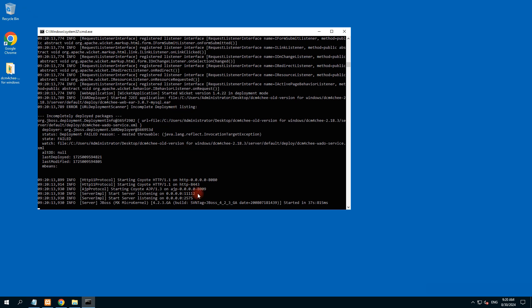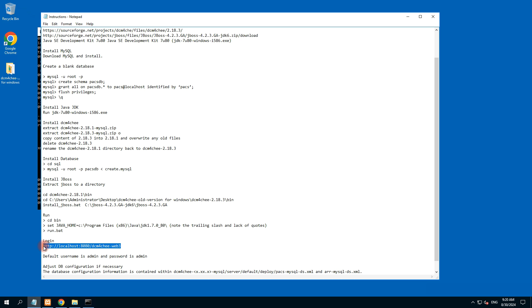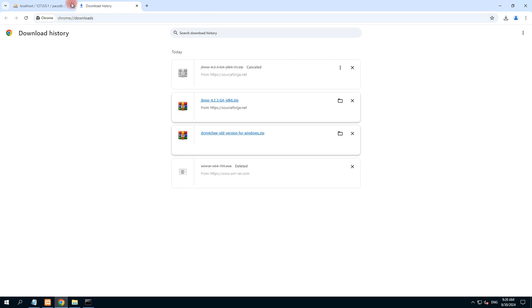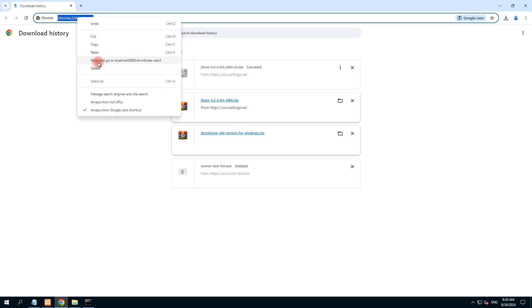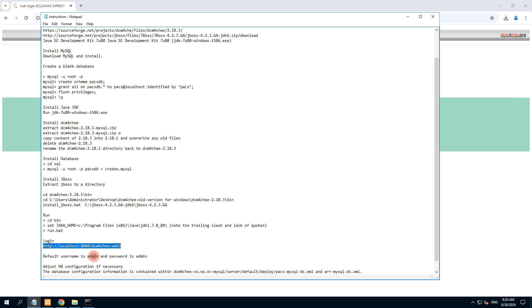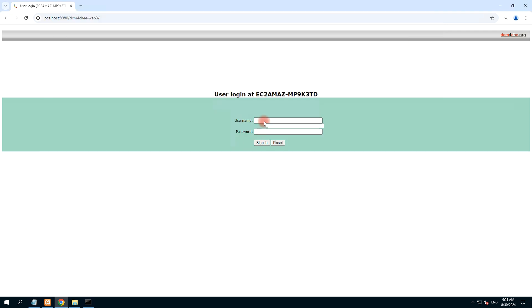It is now listening — listen started. Copy this address and open it in the browser. It's the main page of DCM4CHEE. Click on it. The default username and password is admin/admin. If this password does not work it means you have wrongly configured the database. Type 'admin' for username and 'admin' for password and click sign in.